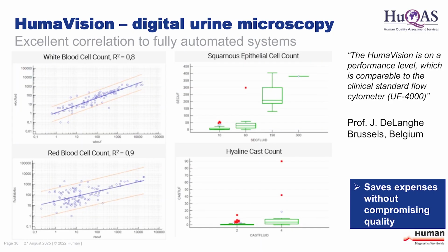The second column shows the normal ranges for each parameter. There we did a literature survey and put all the normal ranges into the system. So what is not available globally in the guidelines is already in the machine in terms of reference values as well. We asked whether you report in high power field, low power field, or in absolute quantities. Absolute quantities would be in microliter. Of course, only 12% did, and I think only these people used a counting chamber or maybe a fully automated system.